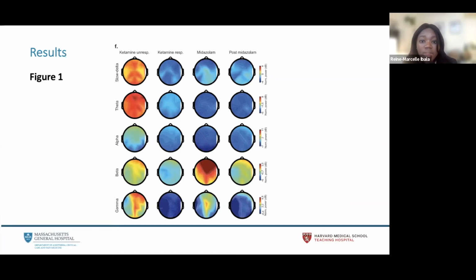Then post-midazolam, as you can see, we see a reversal to what we deem to be a little bit more baseline, which is seeing an increase in power in the alpha wavelength area, mainly the 8 to about 11.7. You see a lighter blue there, and then also a decrease in power between 15.6 and 45.4 hertz as compared to midazolam. You see that the midazolam beta and the midazolam gamma go from this bright red to more of a green, and in the gamma go from the green to the darker blue. So that's showing a decrease in activity at those wavelengths.